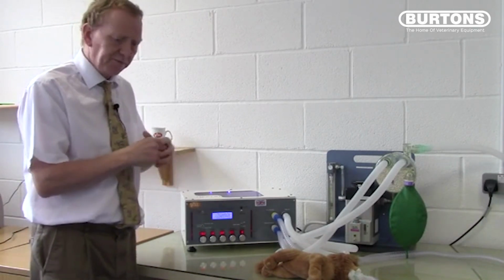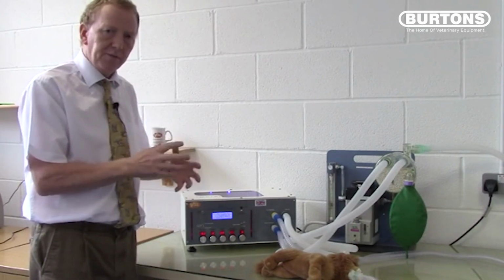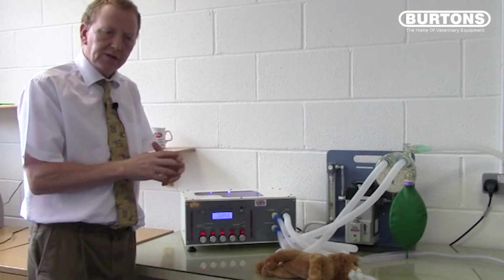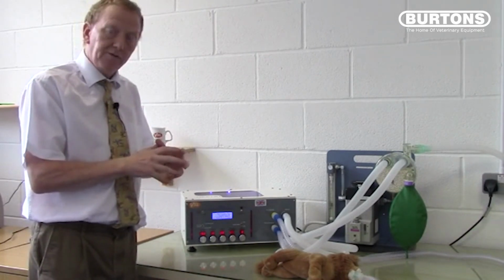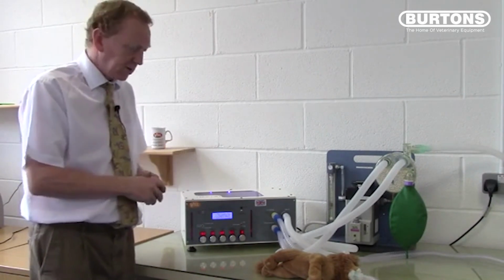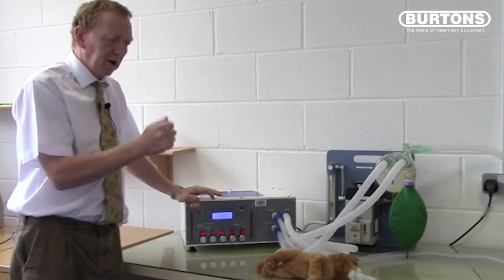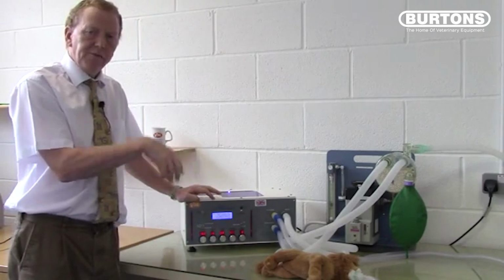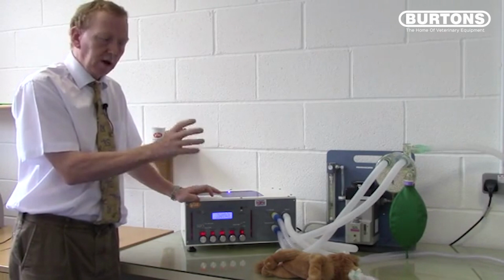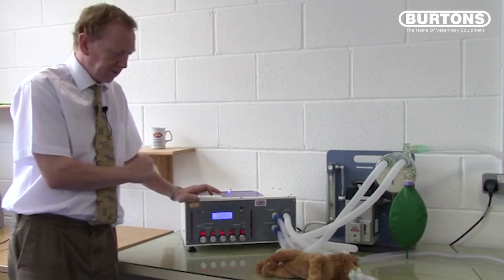With pressure cycling, the flow is delivered until a certain pressure is reached, which will achieve the same function, but if we occlude the chest or interfere with delivery in any way, we are certain that the pressure will never be exceeded, and we'll demonstrate this now. In the previous demonstration of volume cycling, we gave 150 mils to Leo and he got a peak inspiratory pressure at the end of inspiration of 12 centimeters of water pressure.